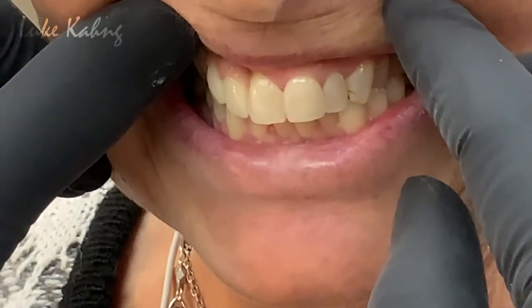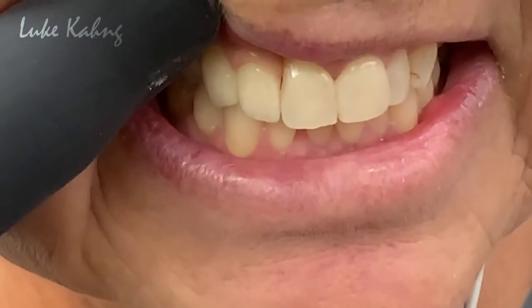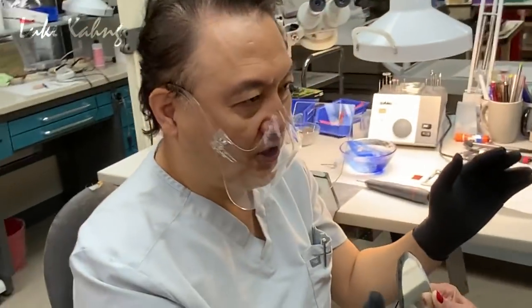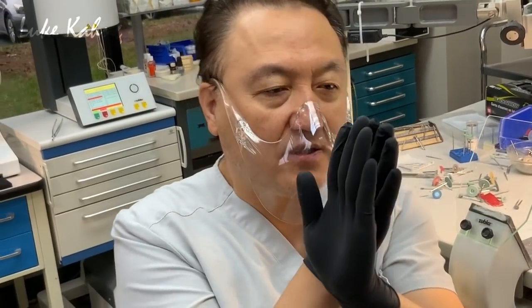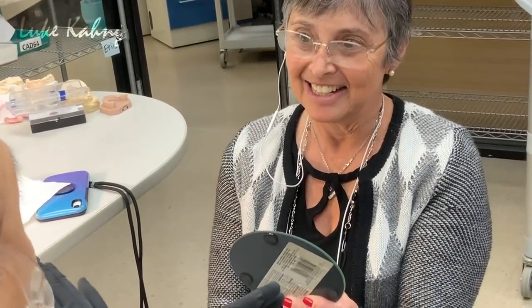Now the third one is slightly different too — you can see here the gum. That's why I don't want to put the tooth too thick. That's not necessary because this one has an undercut. Remember, before my teeth did not go down? Because I added too much, so it did not go down — it has an undercut. So I have to do some grinding. When you go grinding, there's a slightly small gap. Otherwise you can't get the tooth in. Otherwise I have to grind the natural teeth, which is not recommended.